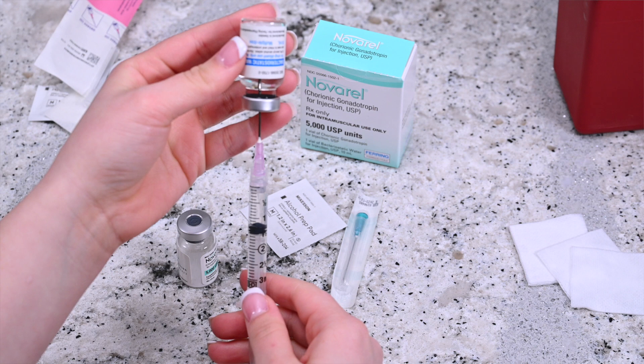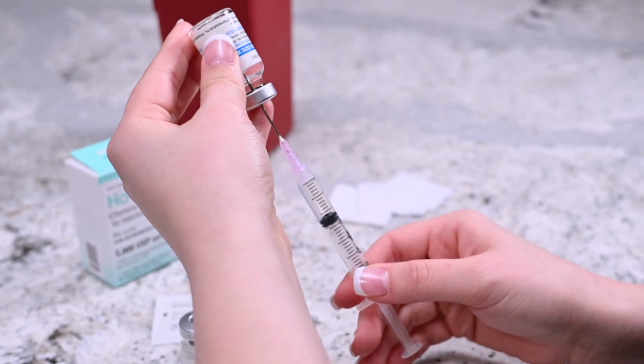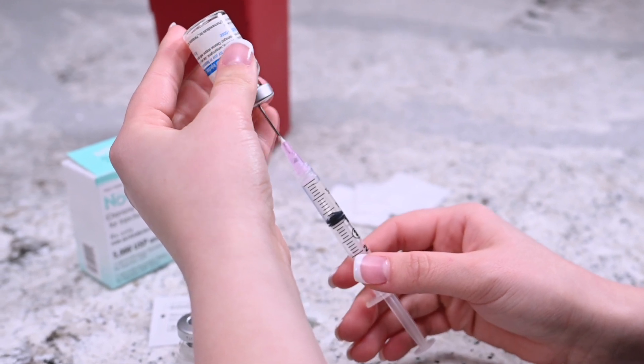Pull back on the plunger of the syringe and measure the proper dosage. Keep the tip of the needle immersed in the solvent by moving the needle down as you draw the medication.